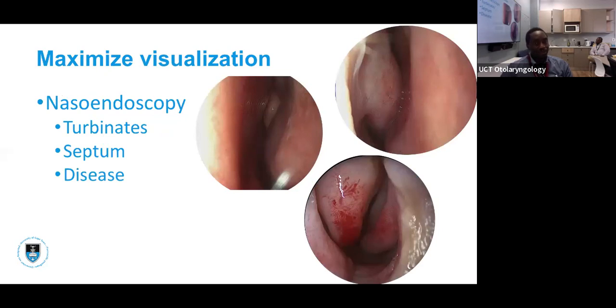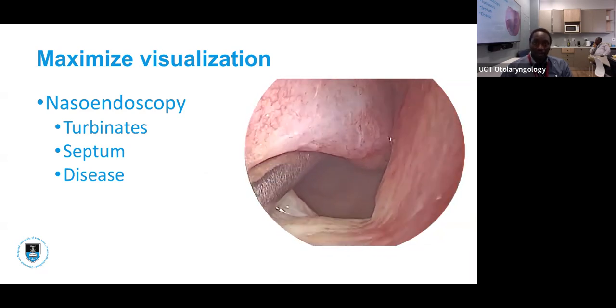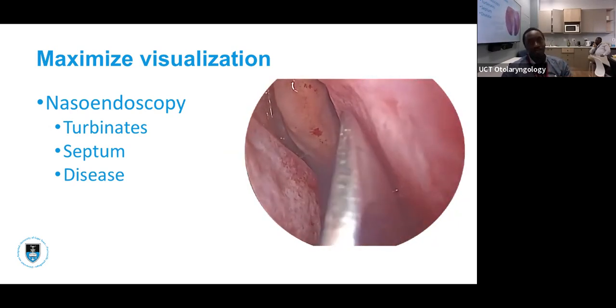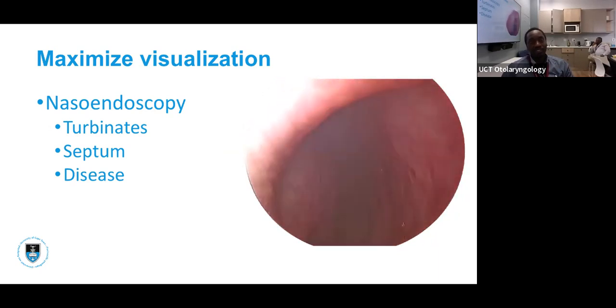Preoperatively, nasal endoscopy is very important to familiarize yourself and plan ahead of what you're going to do during endoscopic sinus surgery. Enlarged turbinate, deviated septum, or other disease that you can see here, variation. This is a concha bullosa. It's massive and it's mostly anterior. It almost looks like a turbinate itself, even bigger than the turbinate. And prior to surgery, to achieve significant exposure, visualization or lateralization of the inferior turbinate can give you an extra space, a few millimeters that you can utilize to put your instrument and endoscope, making it possible for you to complete your surgery in an effective manner.